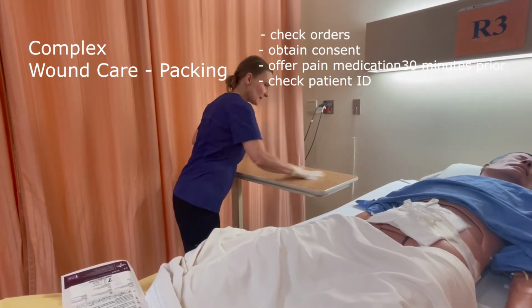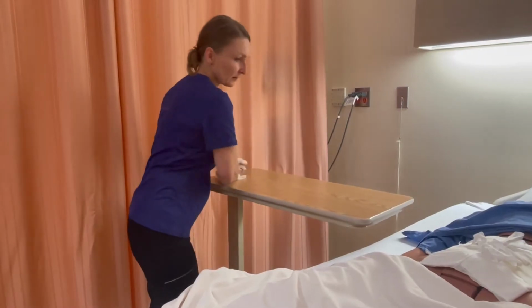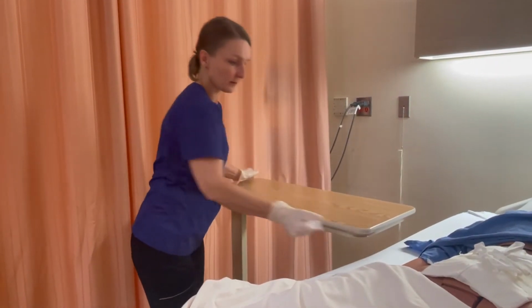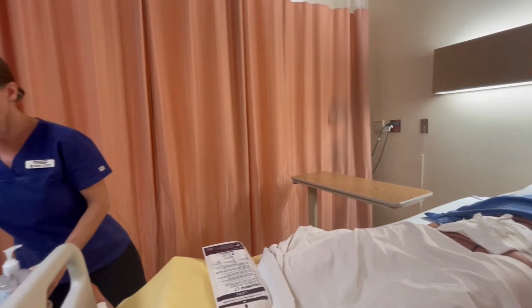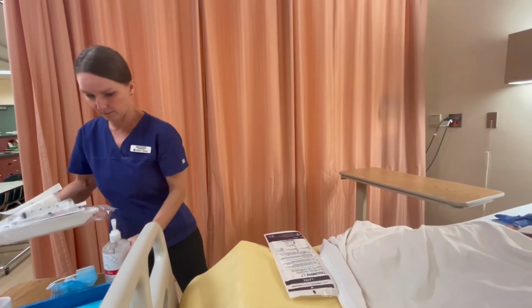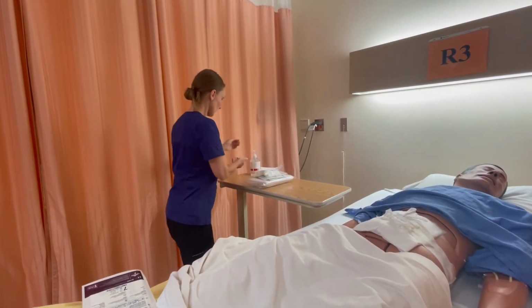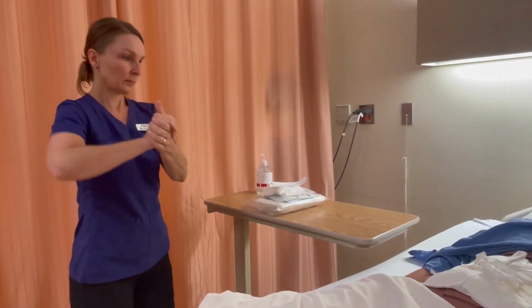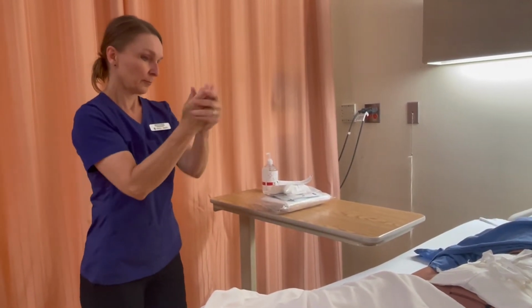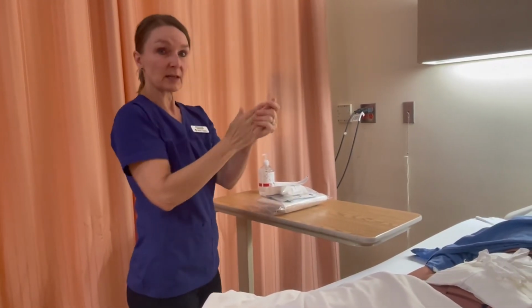Okay, I'm wiping my table in preparation for wound care of my patient. Letting it dry. I'm going to perform hand hygiene. And I'm going to set up my tray.